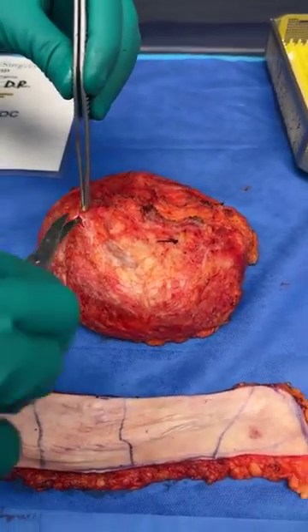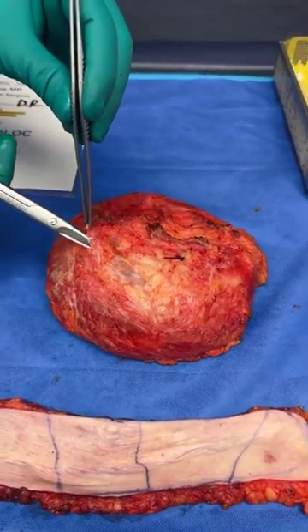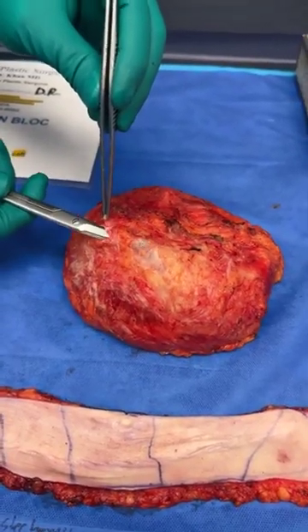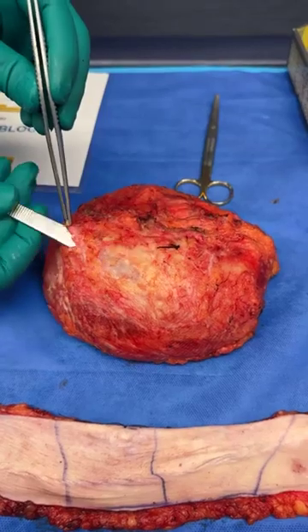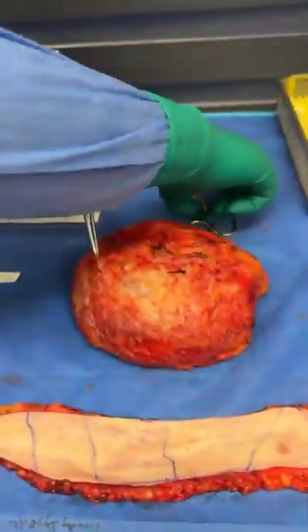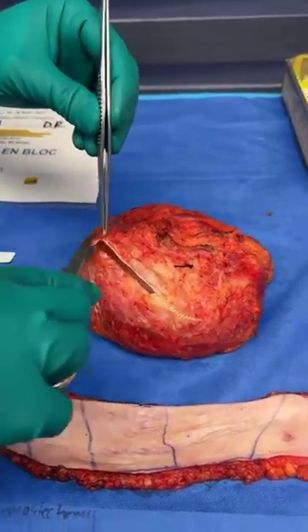I want to just show one thing. If I take my instrument and I put it right here, you can see how thin this is, right? You can see, look how you can see my scissors, right? If I take the back of the knife and I put it, you can see how thin this is. Obviously the AlloDerm is very thick, but you can see how thin this area is. So if I go in, look at this. Just a 10-year-old set of implants.